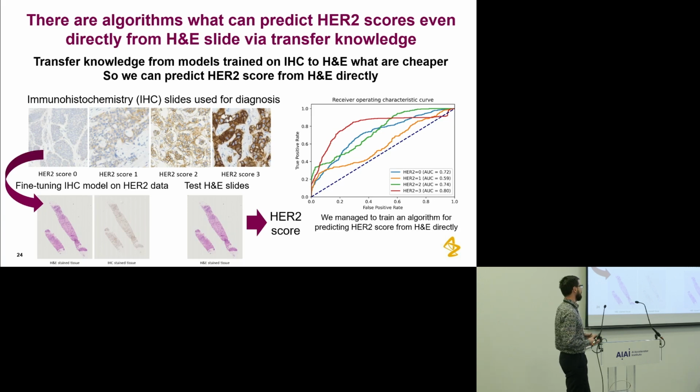Because the power of these algorithms is that they need a lot of data and a lot of variability. And if you take a whole slide image, it's billions of pixels, but how much variability is within that sample compared to other samples? On top of that, in the real world, we mostly have biopsies, right? And if you look in the literature, many algorithms are trained on resections, huge pieces of tissue. Performances are nice, but when you go to the real world and to biopsies, it won't work. It's something I think the community is trying to solve, but I don't have a solution for this.